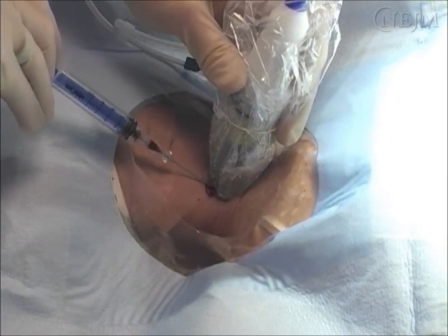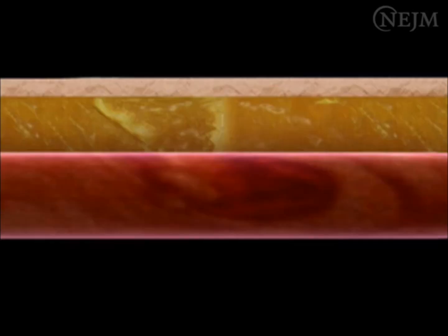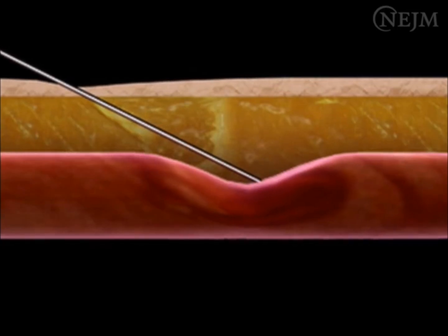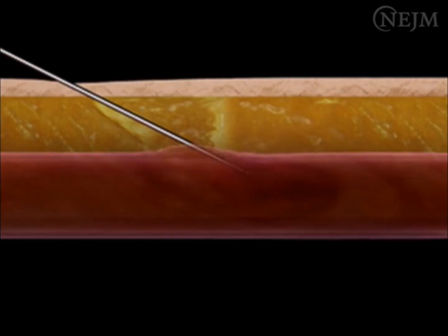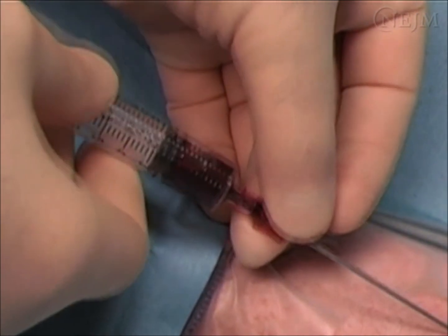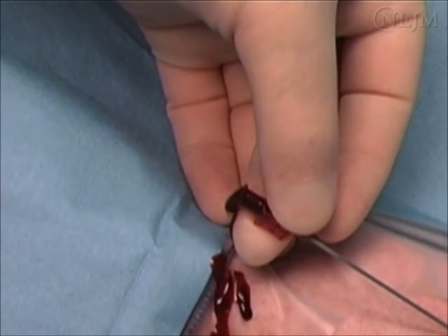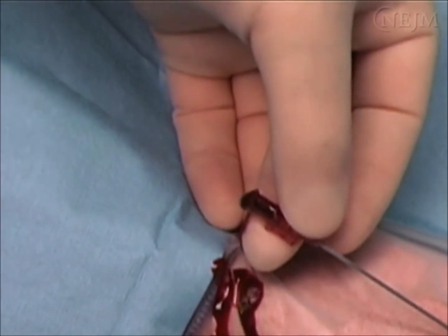When the internal jugular vein is entered, a flash of venous blood is obtained. Because of the collapsibility of the vein, this commonly occurs while the needle is being withdrawn, which tents the vein. Once the needle has entered the vessel and steady blood return has been obtained, maintain a steady position of the needle with the non-dominant hand while gently removing the syringe. Dark, non-pulsatile flow confirms access to the vein.